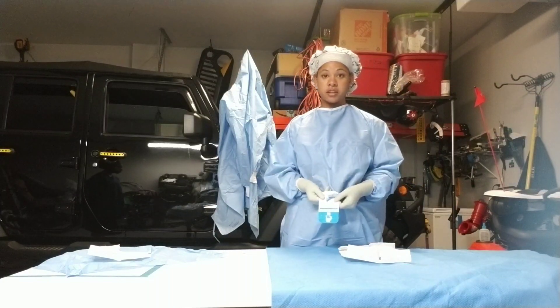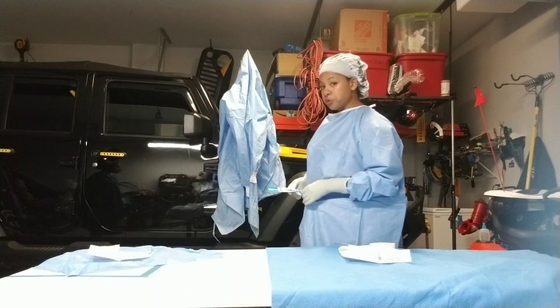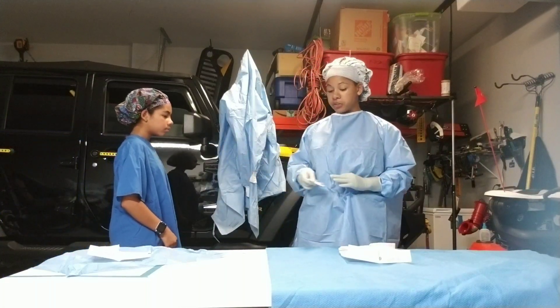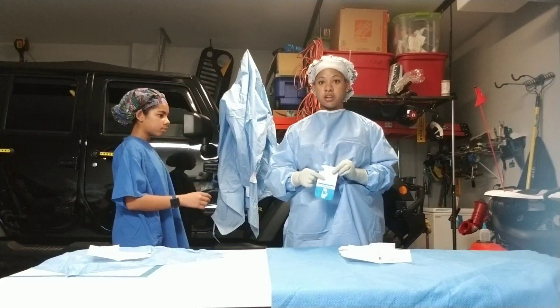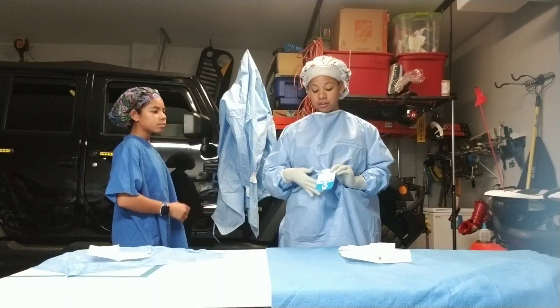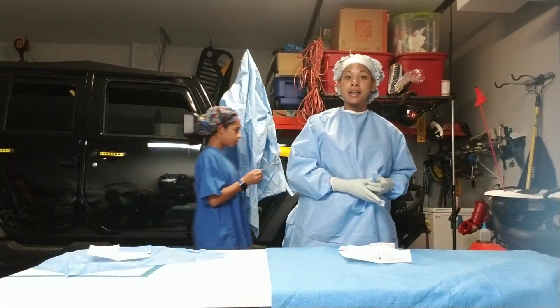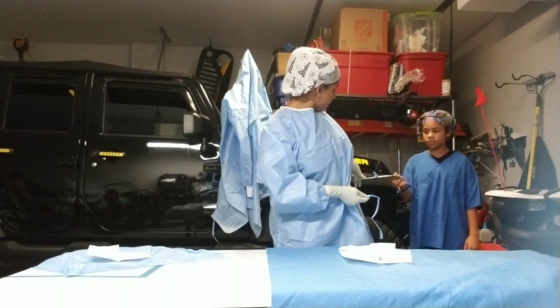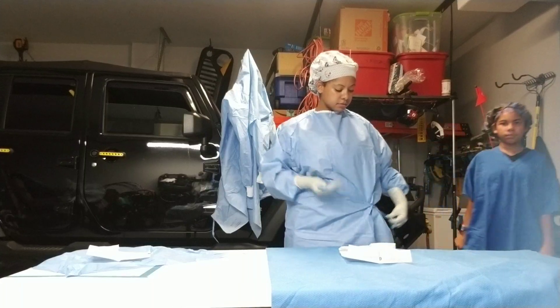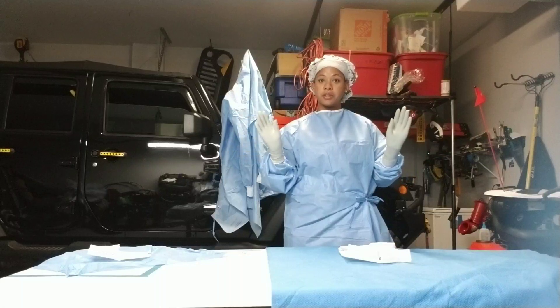Now you're going to grab your card — the left side is your short side, you're going to pull that off. The right side is your long side, that's what you're going to hand to your circulator. As you see, the card is two-tone — that little blue area is the safe zone, that's where they are allowed to grab. You're going to hand it to your circulator, they're going to walk behind you, and you're going to grab your string. They keep the card, pull your string out, and tie. You have gown and double glove.